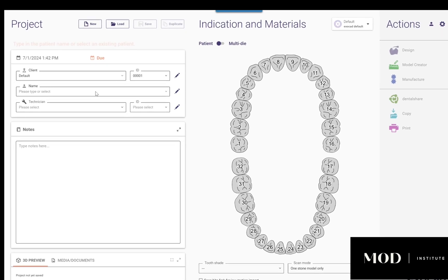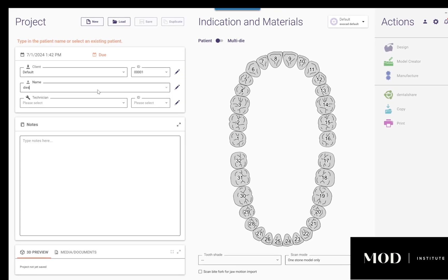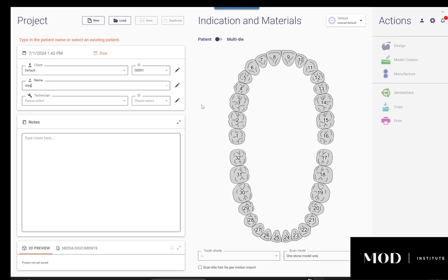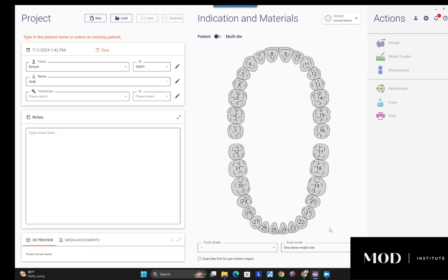Detachable hole-tooth dies on prepped or no-prep veneers. Let's show you how to do this in under five minutes.